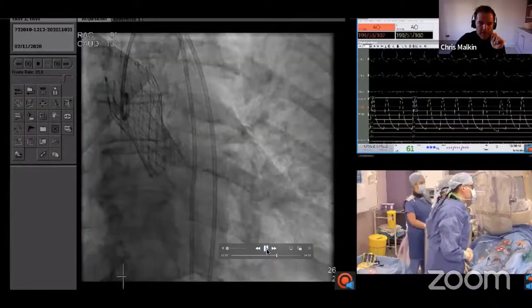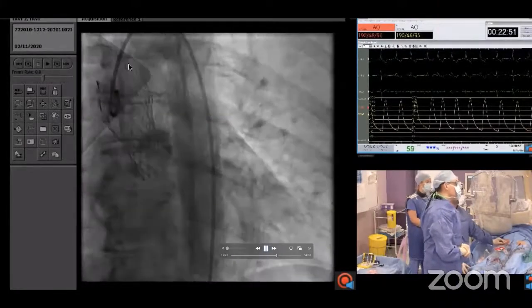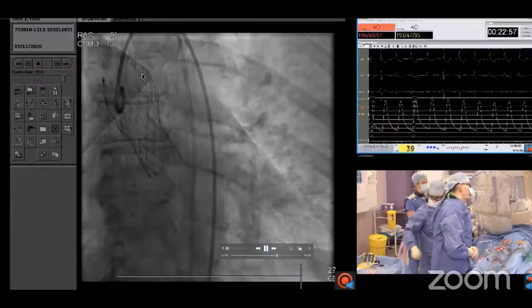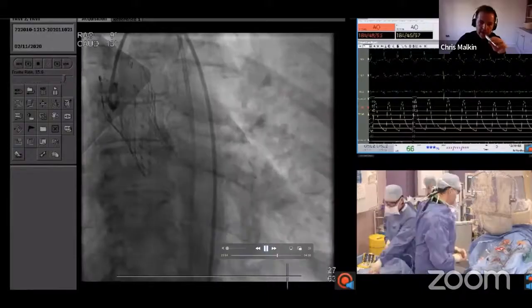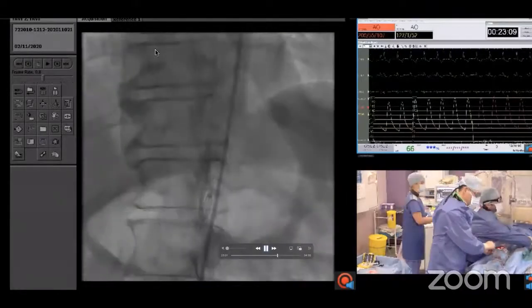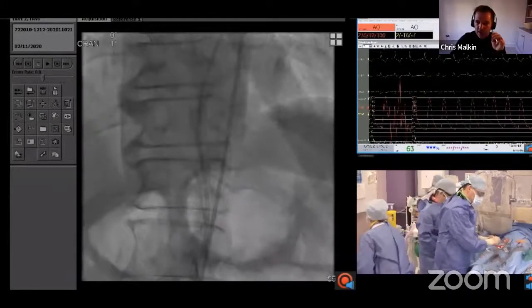Now, if you remember from my initial presentation, I said that if we were going to achieve perfect commissural alignment, the C tab, which you see here, should be on the right-hand side of the screen. You can see that we're actually about 15 degrees off, but that should be enough to make sure that the commissure is at least 30 degrees away from the coronary. But to have it absolutely perfect, commissure of the patient to neocommissure of the valve, the C tab should be on the inner curve on the right-hand side of the screen as you see it.